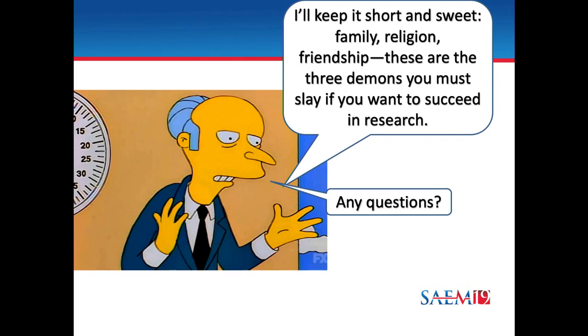But what you can do is you can actually just run the algorithm 5 consecutive times. Generally in cardiology and echo research, when someone's in AFib, they just do it 3 more times. If they normally run Simpsons once, they'll do it 3 times if it's an AFib because of the variability of the R to R interval. With the assumption being that if you do it in enough contractions, your mean will represent the mean R to R interval.